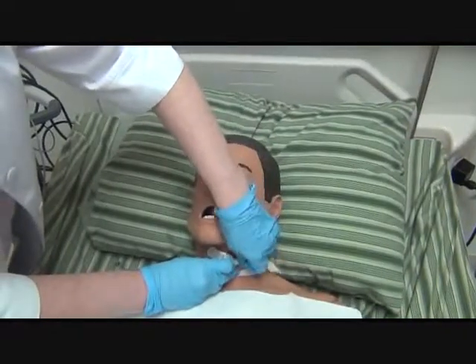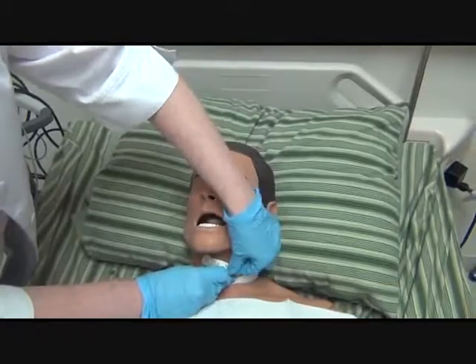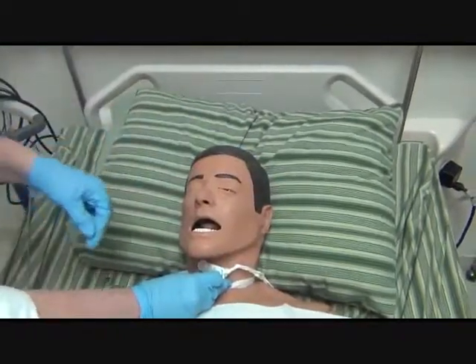Make sure that's good and tight and secured. I've had patients that actually will signal that they want it tighter.